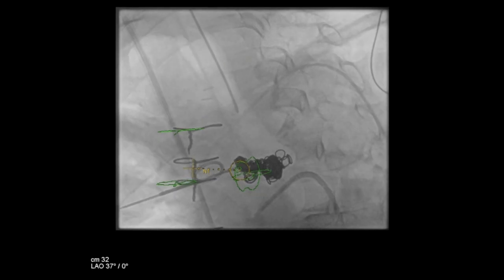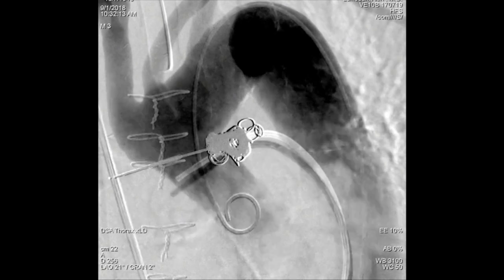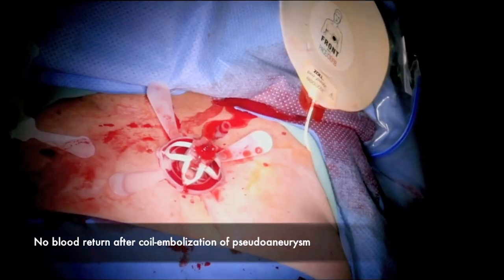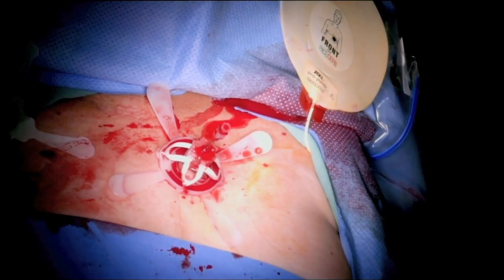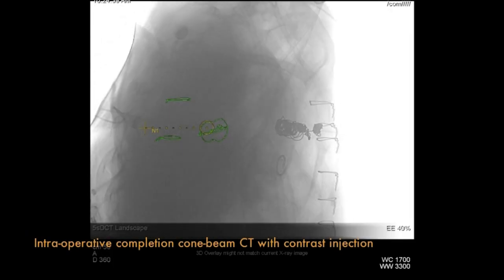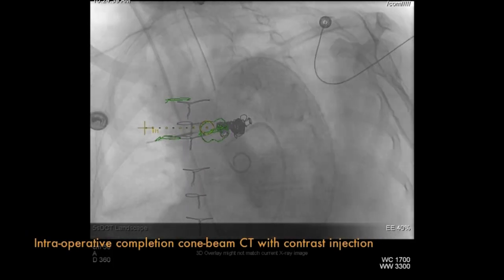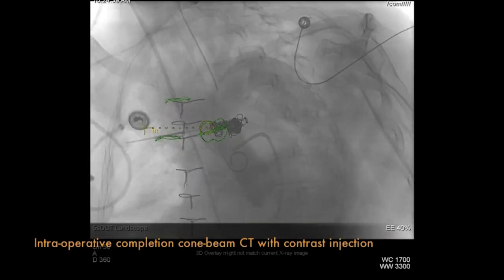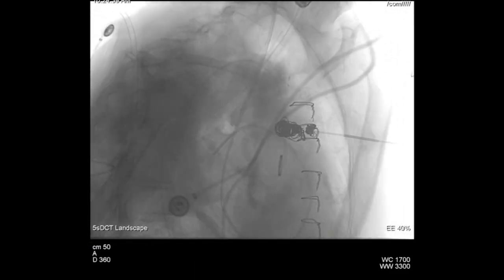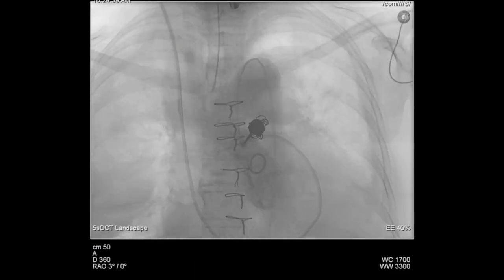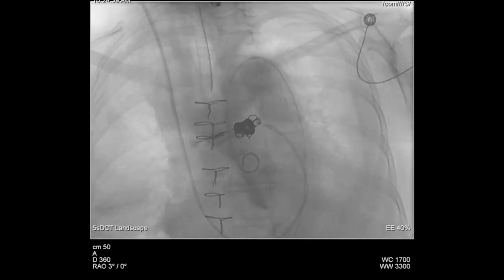At the completion of this, we performed an angiogram at 30 frames per second — there was no evidence of opacification of the pseudoaneurysm, and the previous bleeding from the needle was gone. We then did a cone beam CT, which showed we were in exactly the right location with the coil pack. At that point, we terminated the procedure.